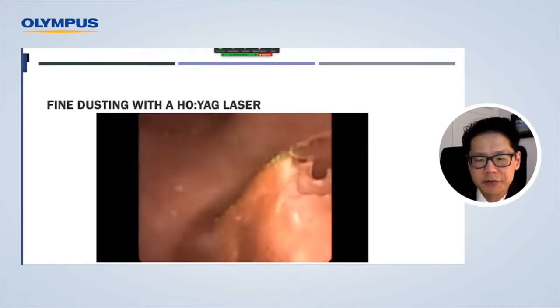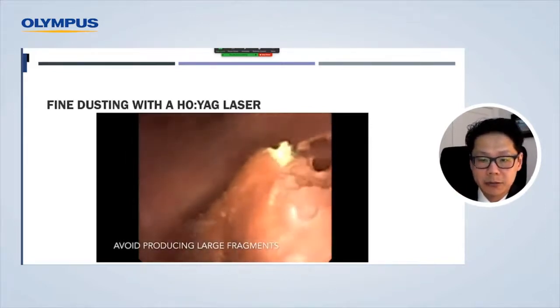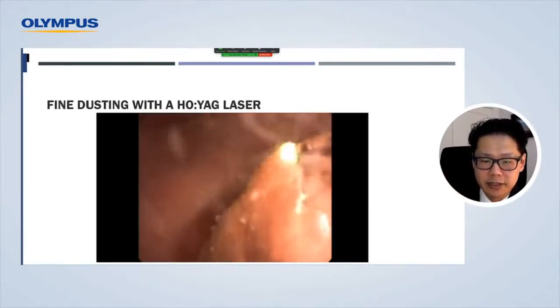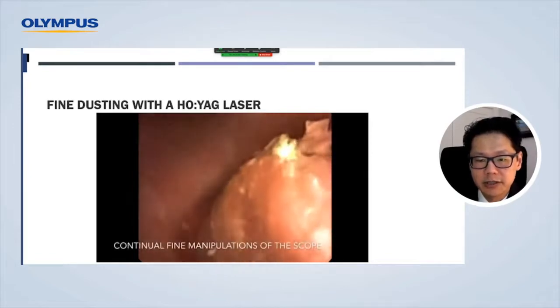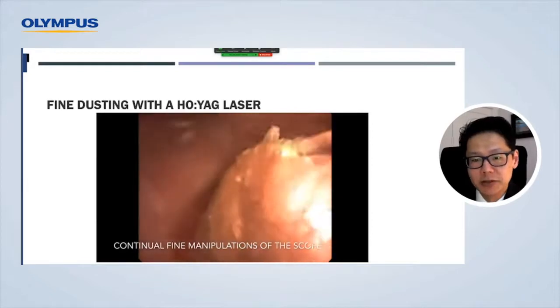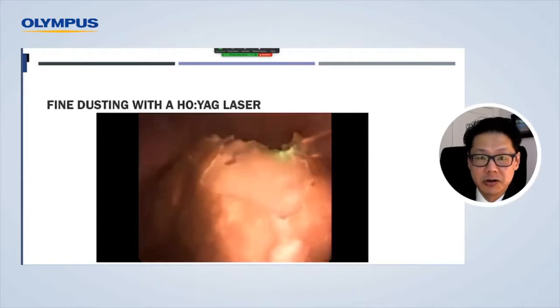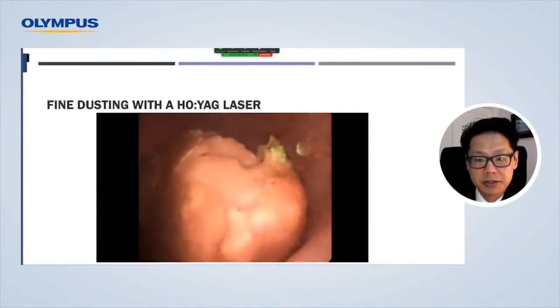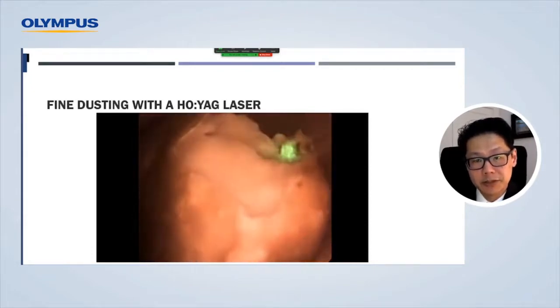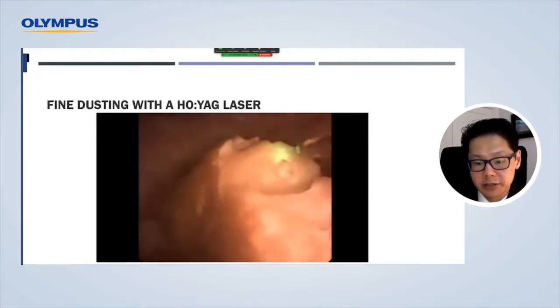Whereas I find that with the thulium laser, we don't need to learn these little tips and tricks to avoid producing large fragments, that essentially we don't need to learn how to do this kind of fine manipulation, that if you just sit there in a calyx and pop dust, it actually works really well. So I've actually changed my technique with the thulium laser. And I found that junior residents who are fairly new to ureteroscopy do very, very well with the thulium laser. So in fact, I worry about them a little bit because when they do go to holmium YAG laser, it's actually a little bit different. And I think that their stone-free rates may not be as good and I have to teach them all these other techniques.